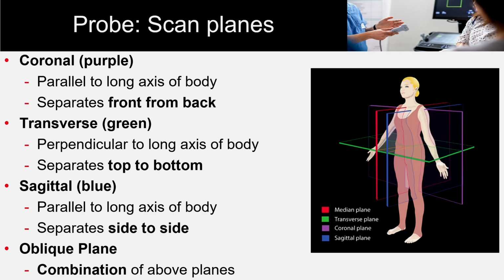The oblique plane is done understanding that there are structures in the human body that are not completely round, ovoid, rectangular, or triangular, that they are obliquely oriented like the portal vein, and that requires a certain bit of obliquity and a combination of all of those three planes.